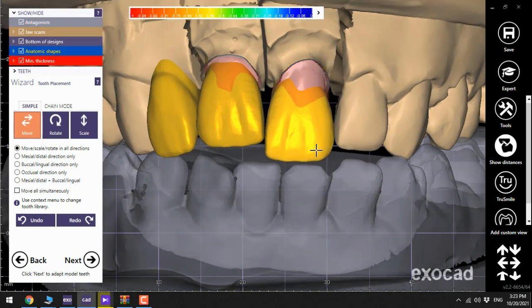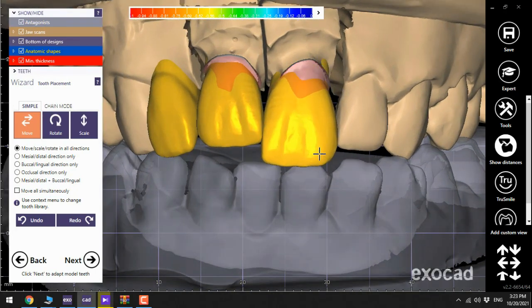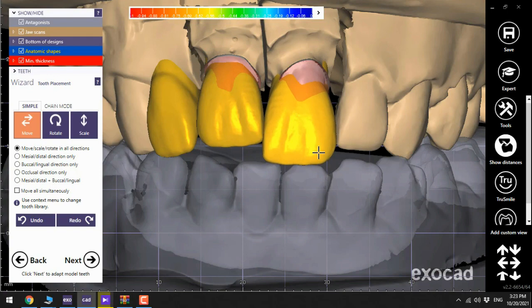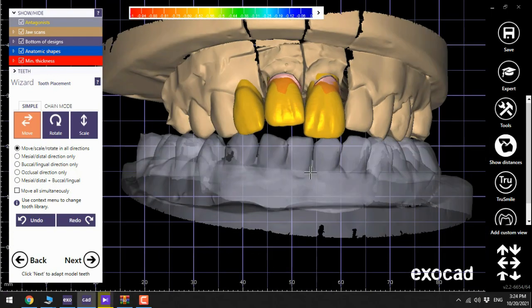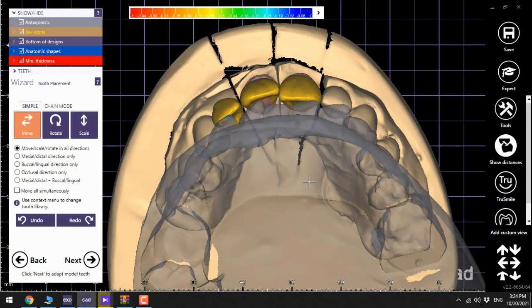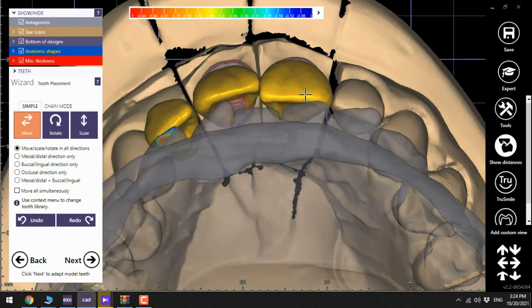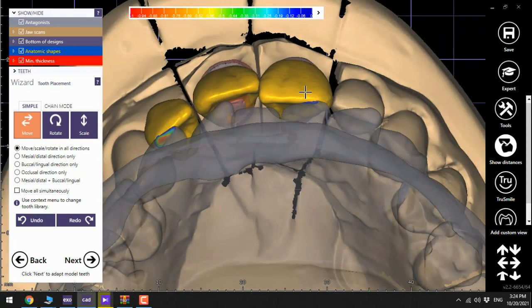Now it's time to do the tooth placement. I always use the hotkeys here that are explained in the separate video.